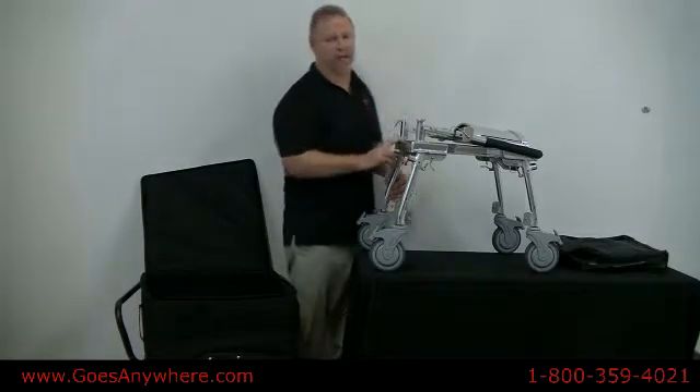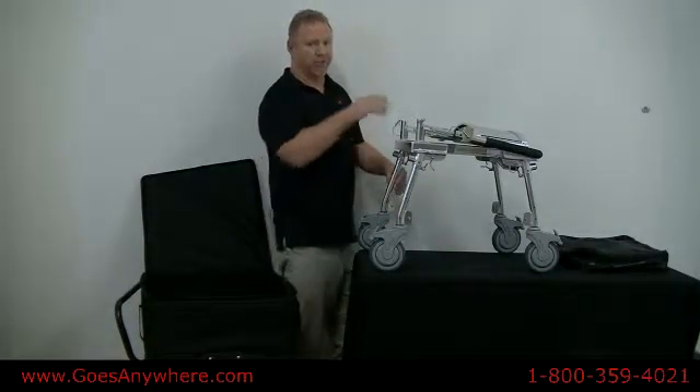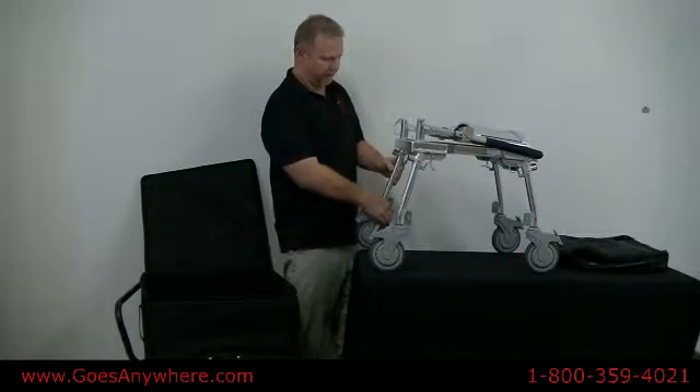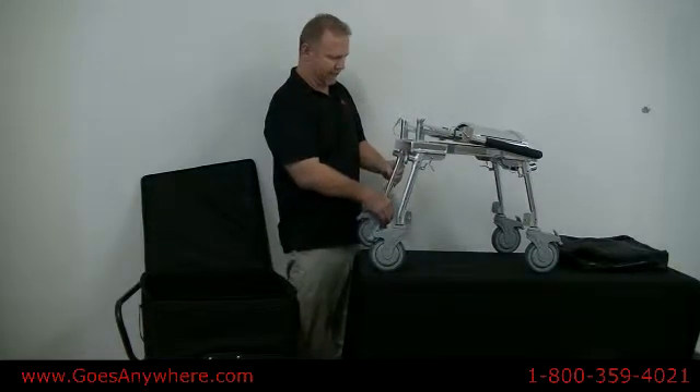To adjust the chair to the desired height, you do that by adjusting the front and the rear legs by just depressing a spring button and raising or lowering as needed.